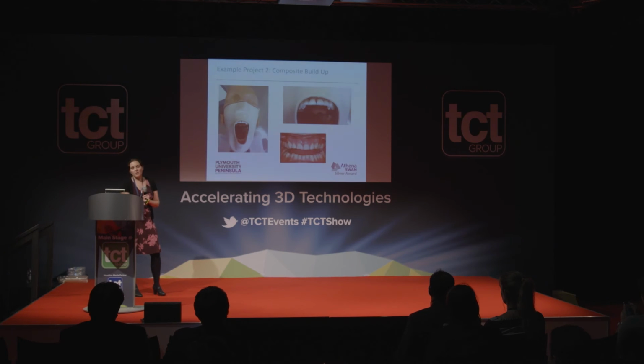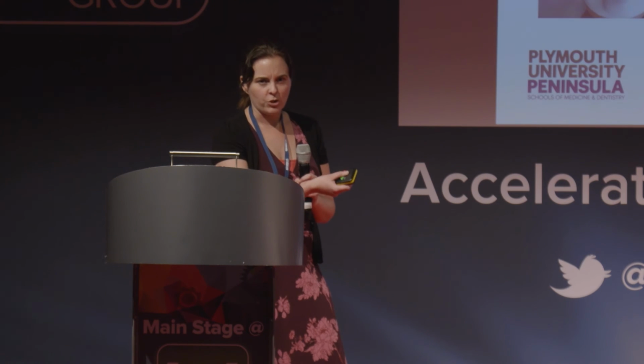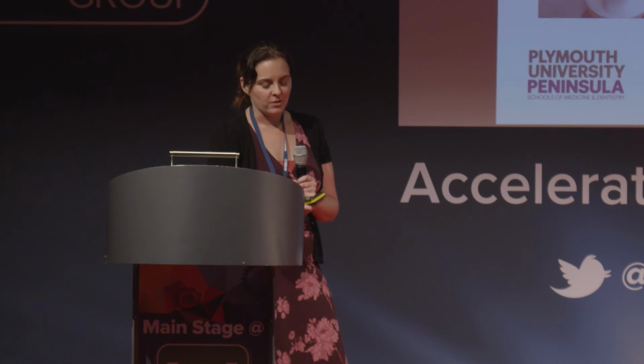I guess again, the only problem is this resin is quite soft, but looking on the plus side of that, it means that our students have to be extra careful when they're polishing the teeth so they don't wear them down. And I think we would prefer our students to be extra cautious with the use of the drill or polishing than the other way. So it actually makes them more cautious when they go on to real patients.